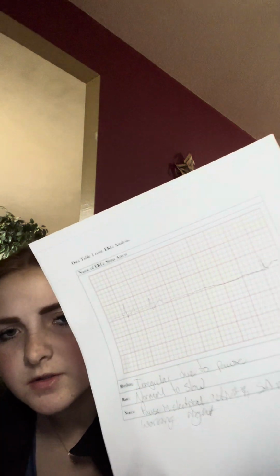So compared to the sinus arrest, the rhythm is irregular because there's a pause in there. The rate is normal to slow, and there's a pause in electrical activity. It's when the SA node isn't working right. So you can see it goes, and then it has a big pause in it, and then it goes. Compared to this one, it just has a steady rhythm.